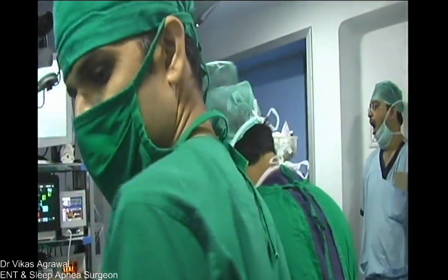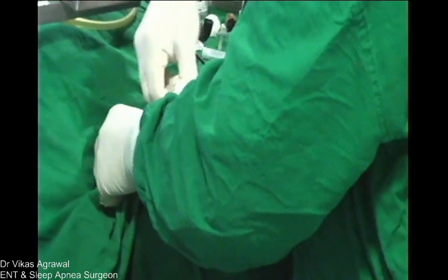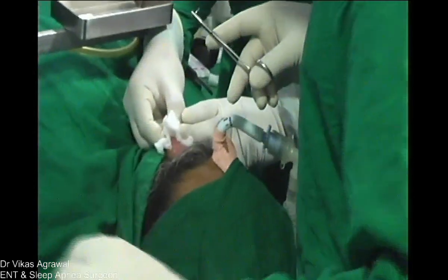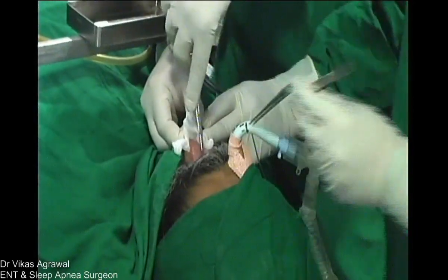Okay, so the external camera can show the preparation for tongue base. So we'll pull the tongue out. What we are doing is, Dr. Sriharsha Thalafule is pulling the tongue out so that I can take a tongue stitch.